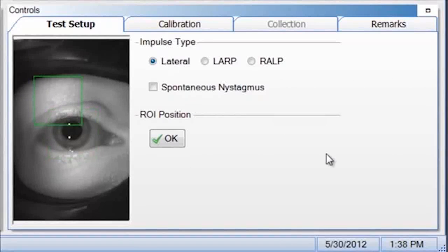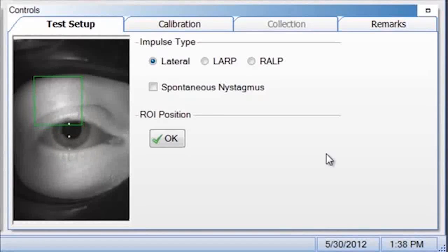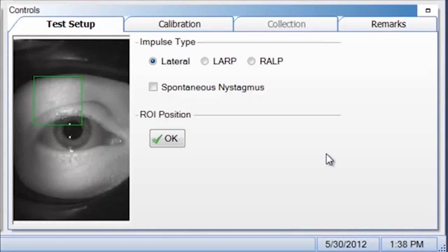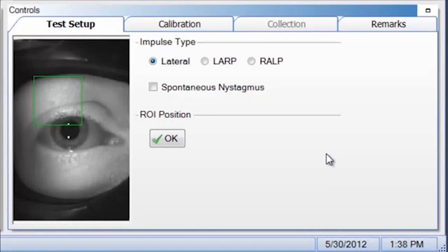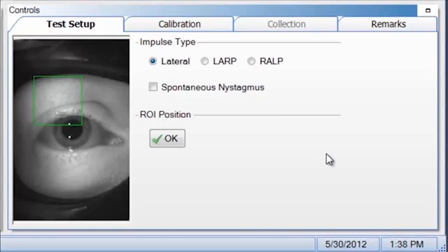Pupil detection is performed to ensure the system tracks the pupil properly prior to calibration. Position the pupil in the ROI region of interest. Over here in the test setup, you see the green square. You want to make sure the pupil is positioned within the green square.